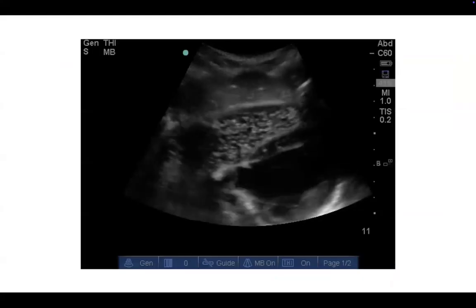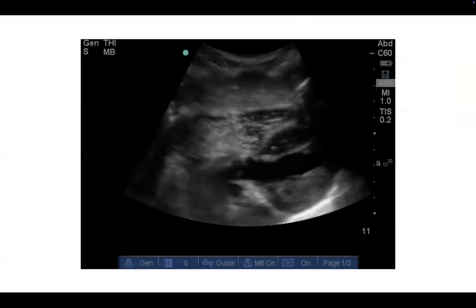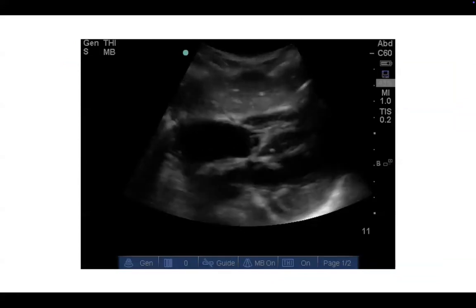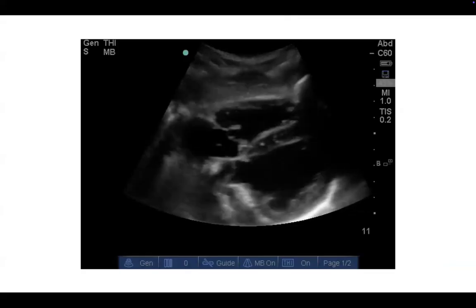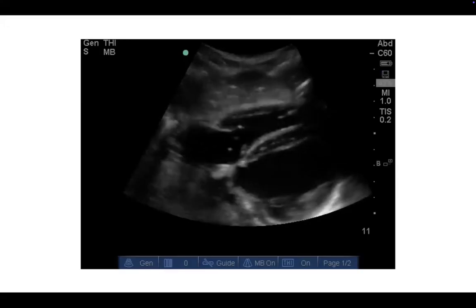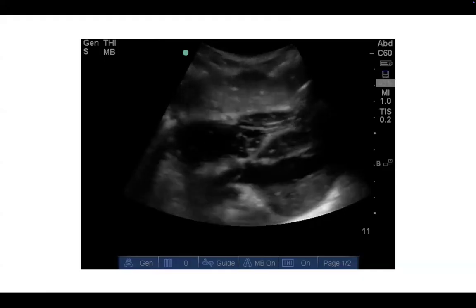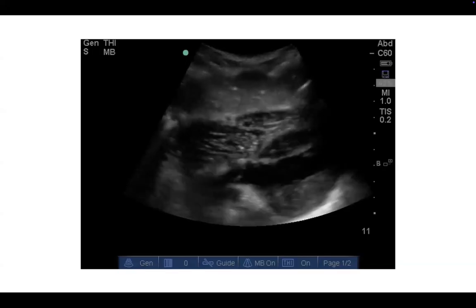And this is another technique, using agitated saline, to determine whether a line is in a vein. We've had a few over the years, and Stasa can probably remember a few, of lines that were inadvertently placed in arteries. So I sometimes will use this if I'm not quite sure in a kid who's pretty shut down. This is a subcostal view. The top part of the heart that you can see is the right ventricle. You agitate saline and inject into the central line with the ultrasound probe on the heart, and you can see that yes, I'm actually in the vein, obviously, because you're injecting into the right side of the heart. So it's an interesting adjunct for line placement, particularly in kids that are pretty shut down and you can't really tell whether this is blue blood or red blood, or whether it's pulsatile or not.